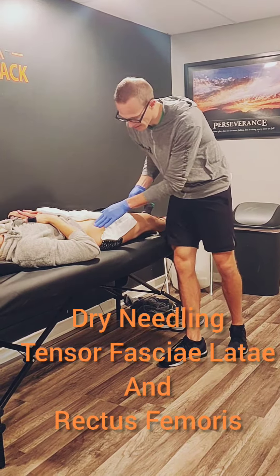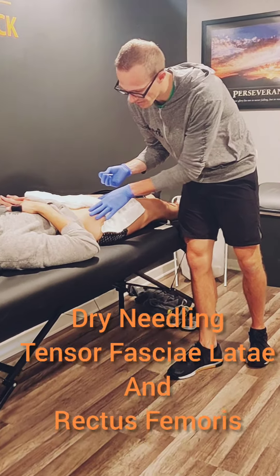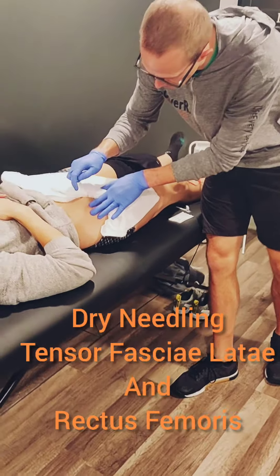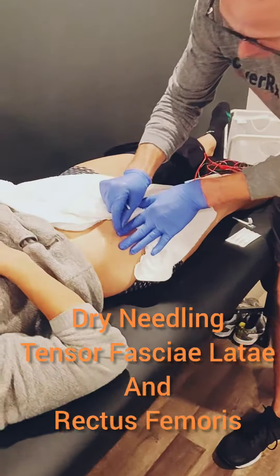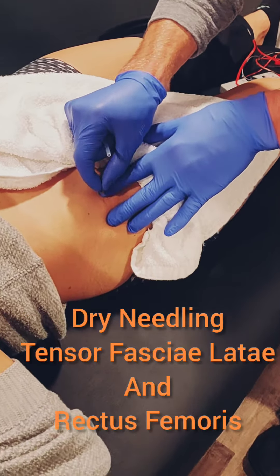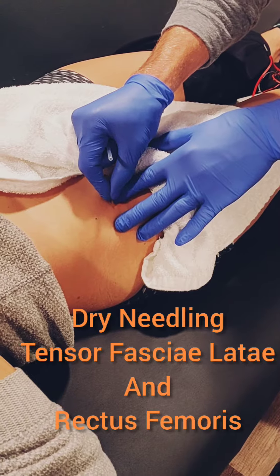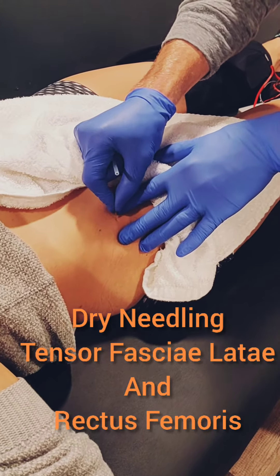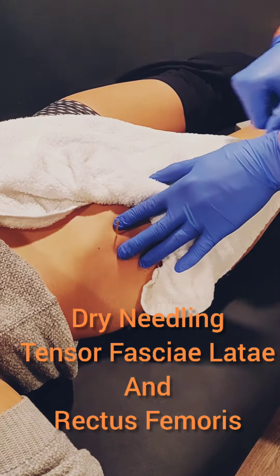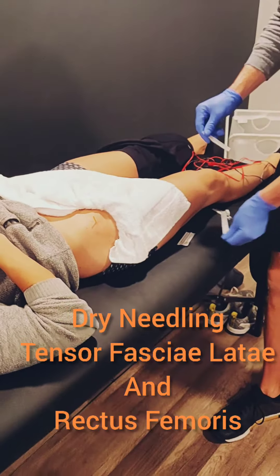Right now I'm going to do a little demonstration for you of needling that proximal quad muscle. She just got a little twitch reaction — pretty normal. I'm going to piston in there, working around, finding those areas, scanning around. I'll leave it in there and give it a little twist. That's the proximal quad.